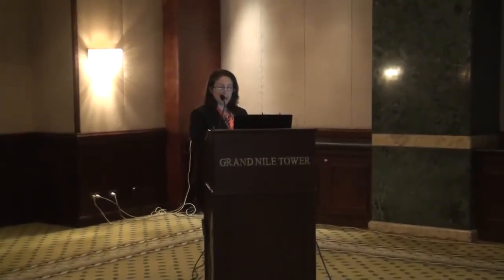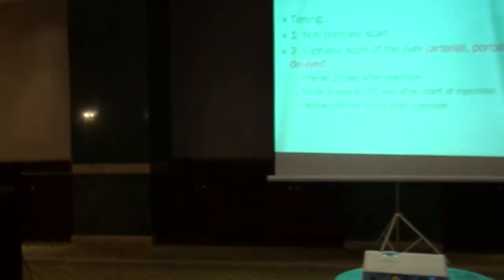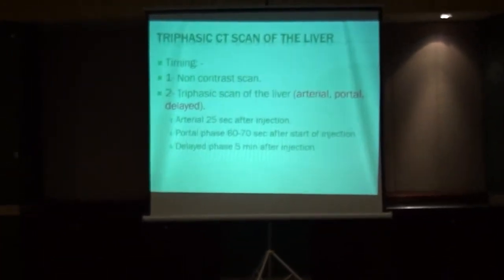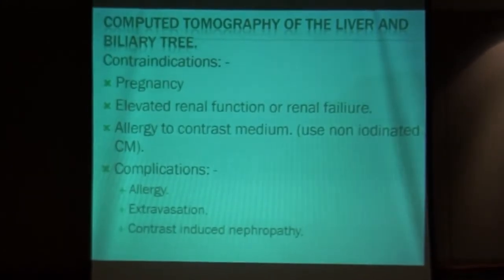Non-contrast scans are taken first, then the triphasic scan of the liver. The arterial phase is 25 seconds after injection, portal 60 to 70 seconds after injection, and the delayed phase 5 minutes after injection. Contraindications to CT: pregnancy, elevated renal functions, allergy.